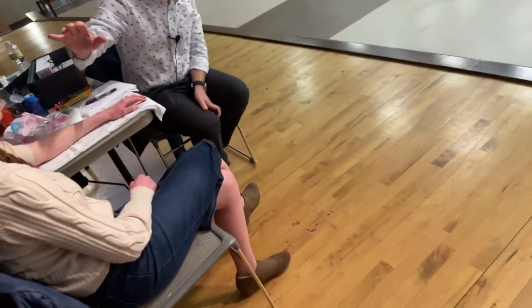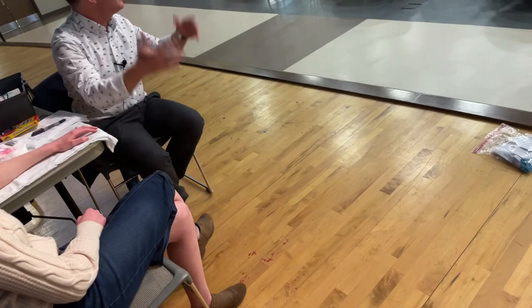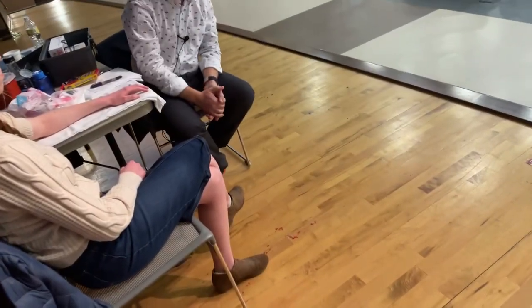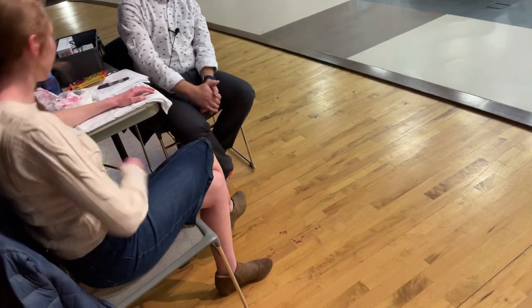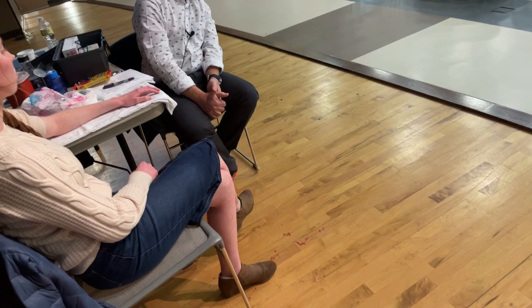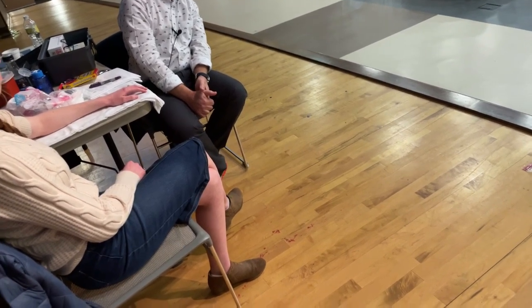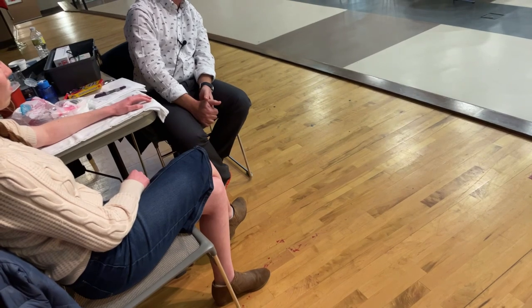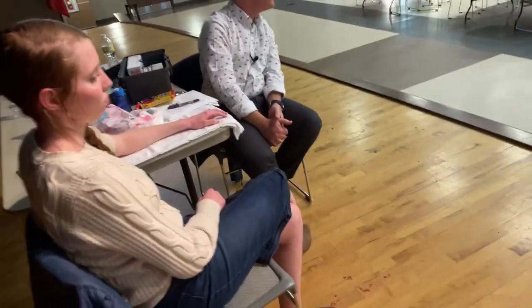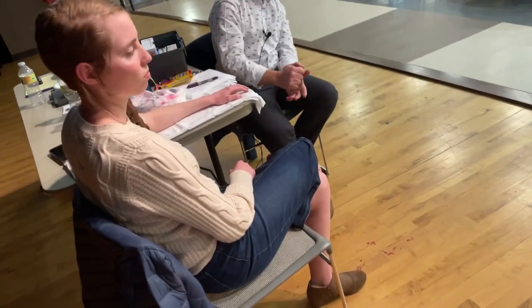I've set up our treatment area. If y'all want to come forward and stand behind me. With the patient, usually the first time we needle, we have them laying down supine so that if there's any kind of fainting reaction or negative response they're in a safe spot. I also want to make sure that they're not going to jerk and pull away during the dry needling treatment.